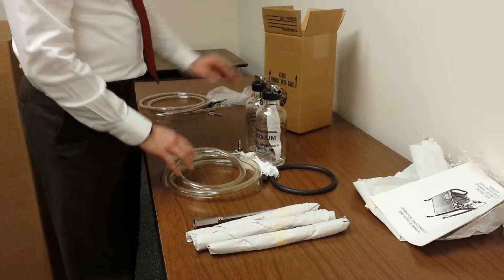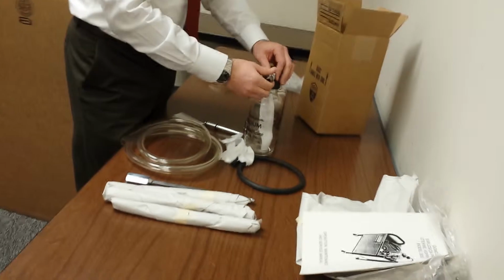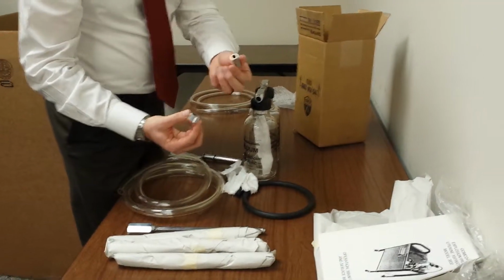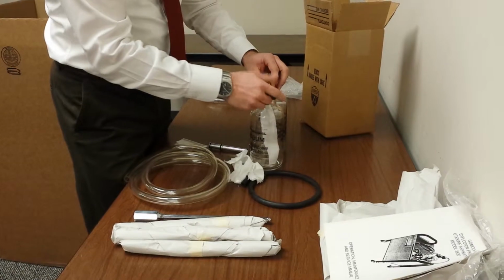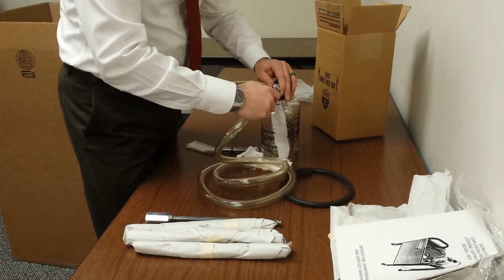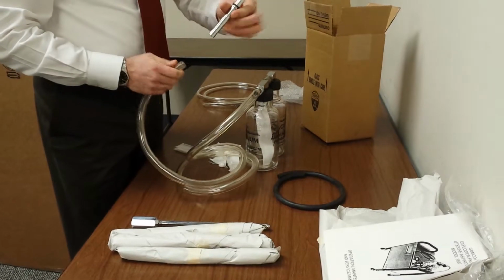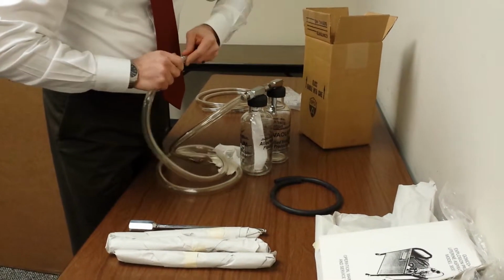So for a reusable assembly, you're going to use the 1/2-inch tubing that's supplied, and as you can see, it's already been set up. This is a removable nut and nipple, set up from the factory with the 1/2-inch nut and nipple. You simply take one end of the clear tubing and put it onto this nipple, and then you take the other end of the tubing, and this is your curette adapter assembly, and you'll put it onto the barbed end of that.